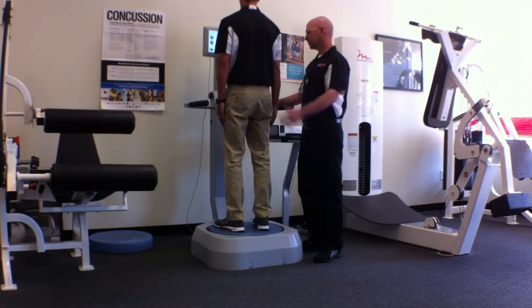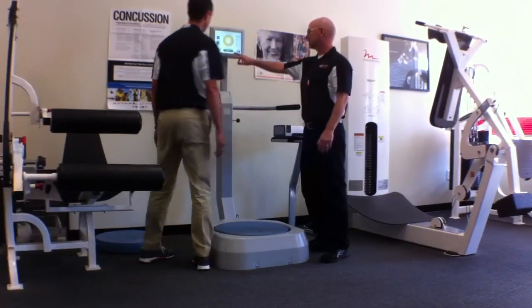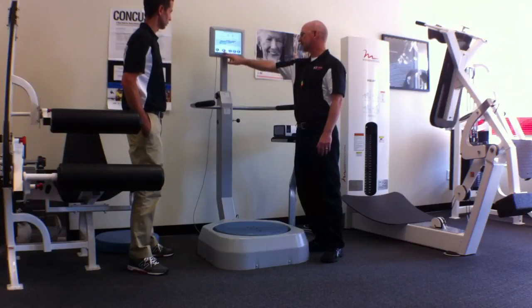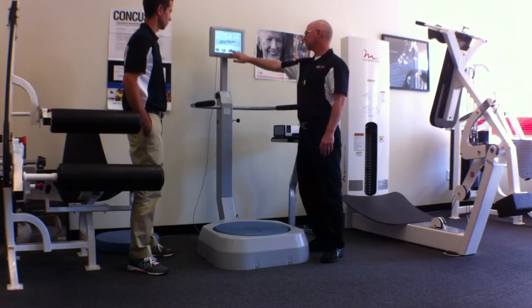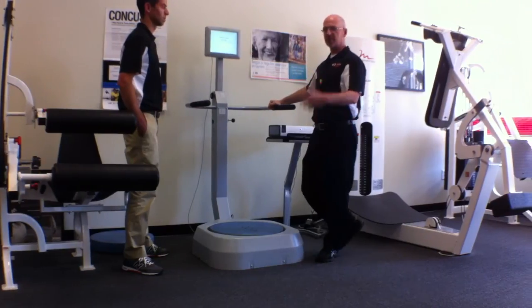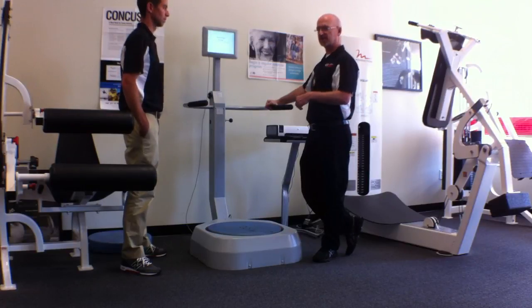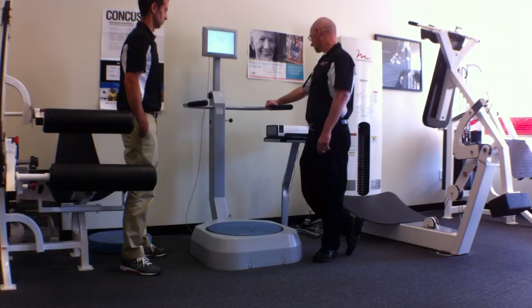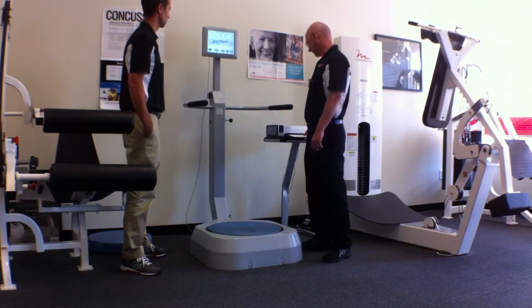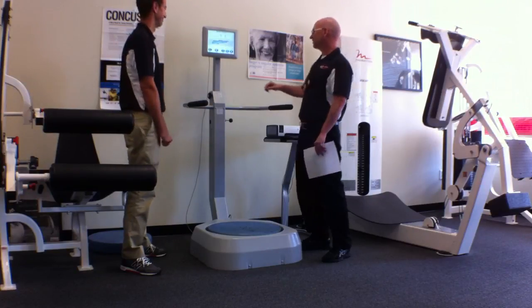Once it locks all the way back up, Peter can step off of there, and you may not be able to see this, but we get a results page. If we want to add typed comments, we can, or we can print it, and it'll print that results. If it's a group of people that we may want to save the results for, if we're doing some work in a doctor's office, we want to save that as well. So Peter's at a very low risk of fall, which is probably accurate. Okay.